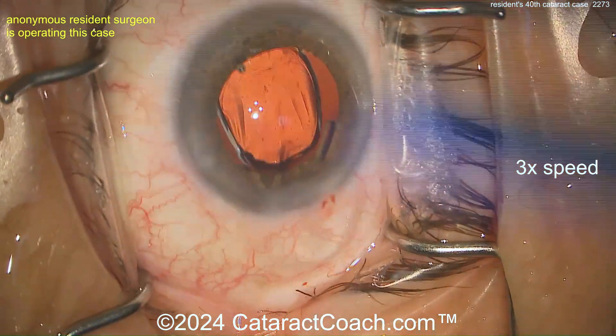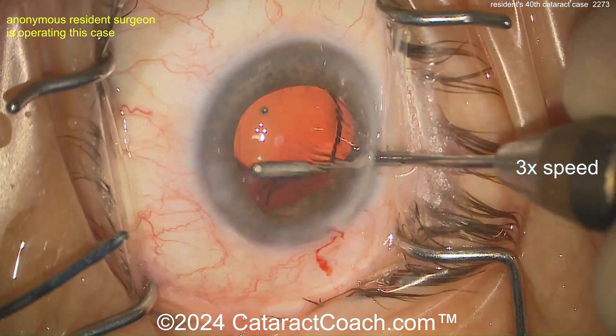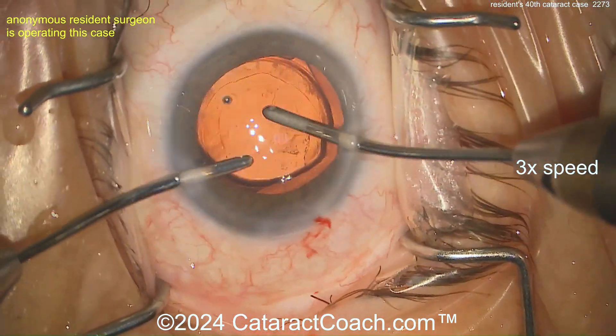Delivering the lens now. Single-piece acrylic lens most likely — there it is. Get that in the bag. We all know it's going to be about a six-millimeter optic. Opening that up — and let's see that rhexis. For case 40, this is fantastic.